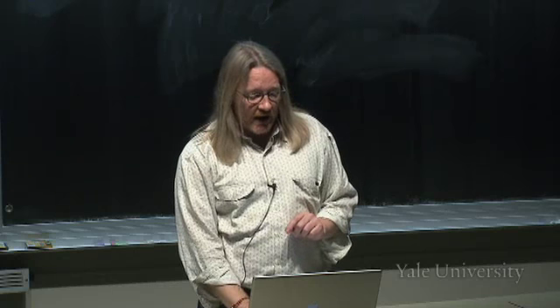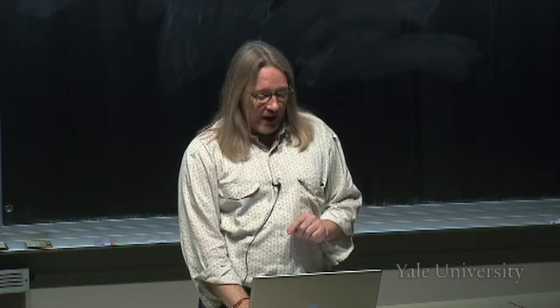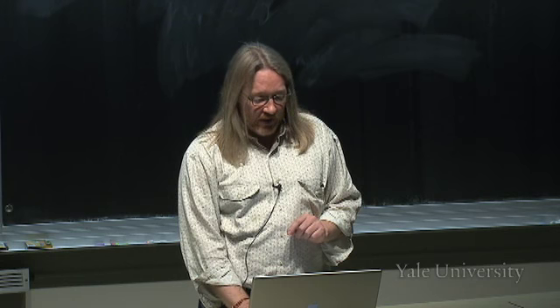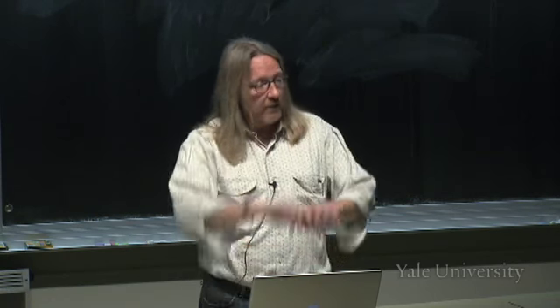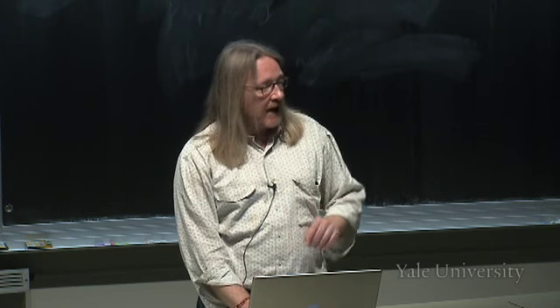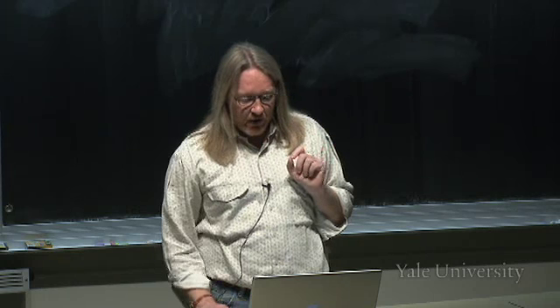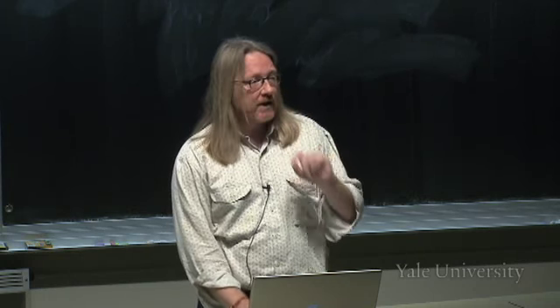And so one can design devices like this endoscope. And with this endoscope, you can look through this end here. It has a light source, and that light source shines through fiber optics that you can bend around, and that light comes out the outside. The light hits some biological object and then bounces back, reflects, and you can see it. And so you can look inside objects where you can put this endoscope.